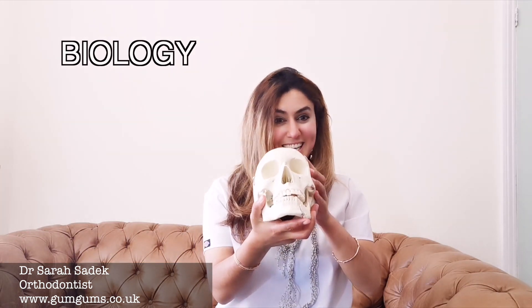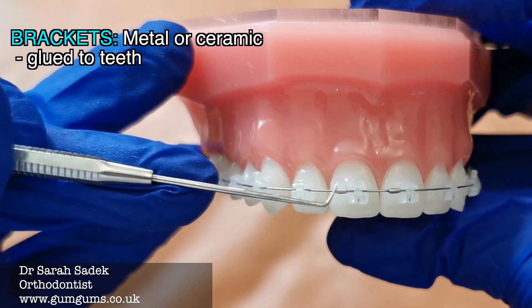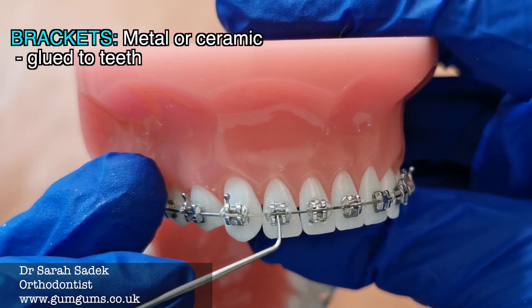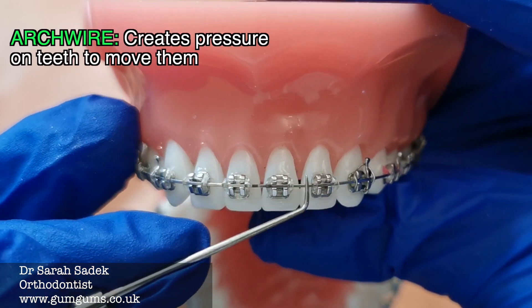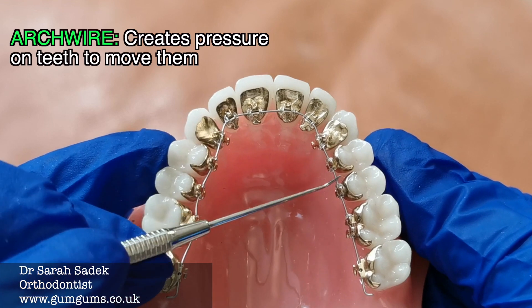For you to understand this topic clearly, we need to put our thinking caps on and I need to familiarise you with some of the basic mechanics and biology. Let's start with the basic components of fixed braces and Invisalign. Here we can see our fixed braces. We have brackets — these are the metal or ceramic materials that are glued onto the surface of each tooth. Brackets are the most visible part of your braces. We have archwires — these are thin, rod-like metal wires that are placed over each bracket. This is the essential component for creating the pressure against the teeth that will gradually move them into the correct positions.